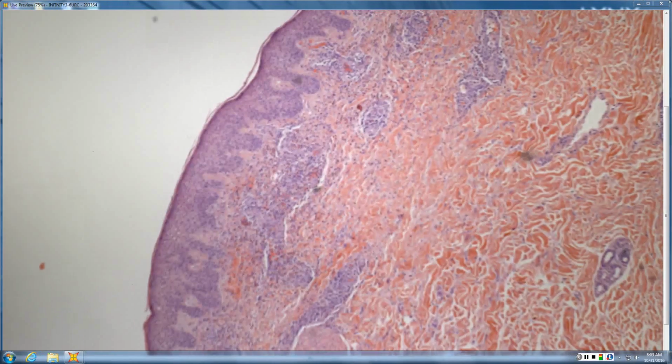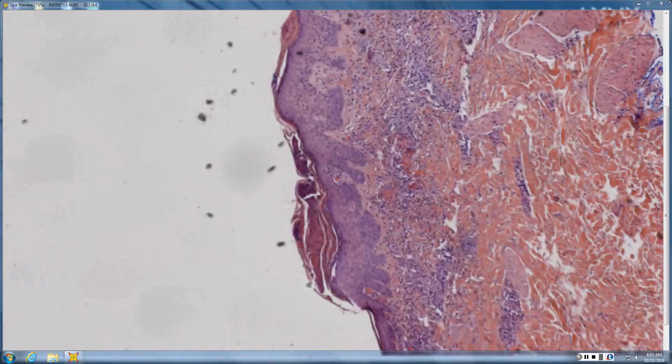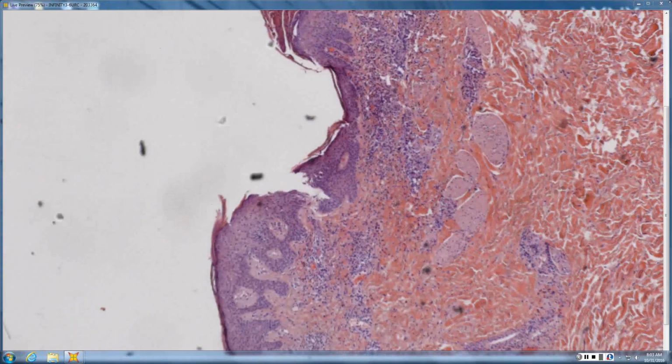Okay, Dr. Dunn. It was a superficial dermal infiltrate.